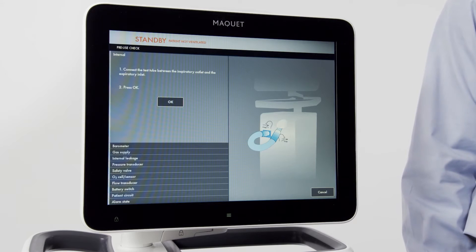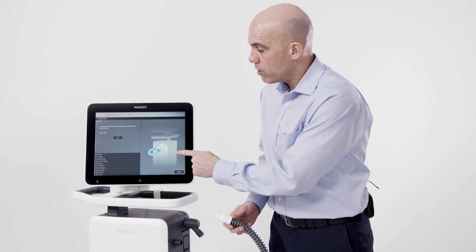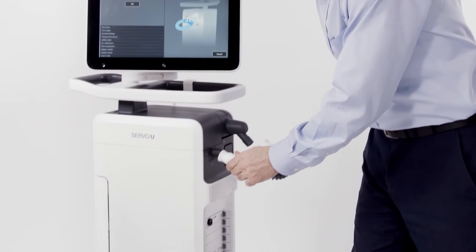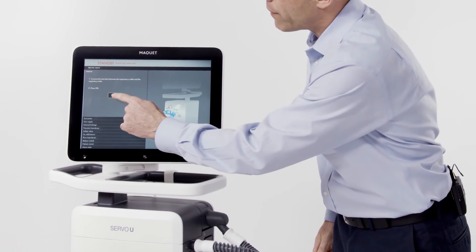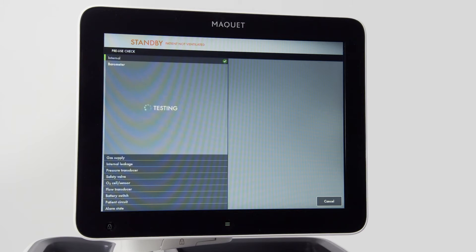Now we're going to do the first step of the pre-use check. The illustration on the screen will tell us what to do. We're going to take our test tube and connect it to the inspiratory and expiratory outlets on the ventilator. Then we'll acknowledge by pressing OK on the screen. We will then continue to cycle through tests on the ventilator.